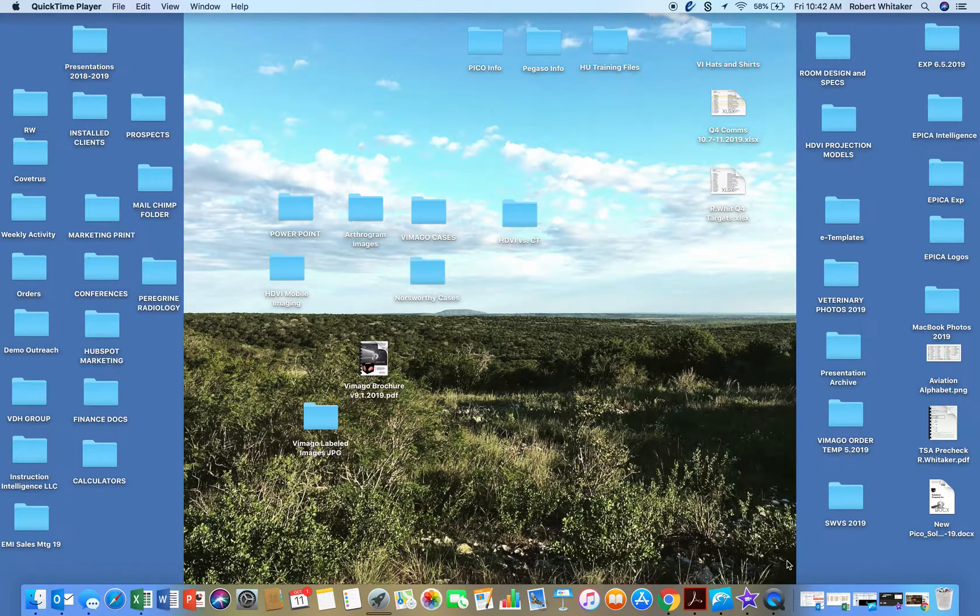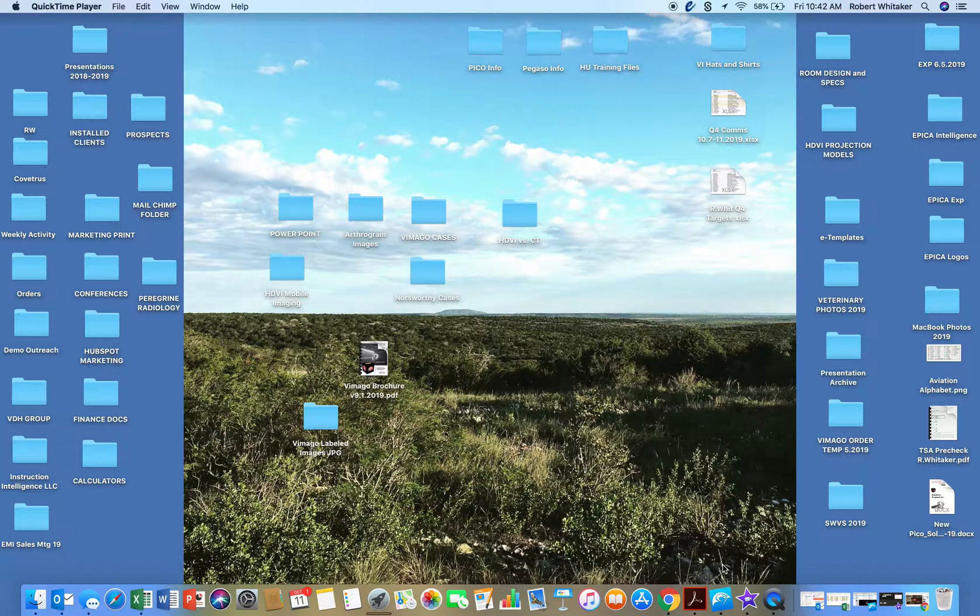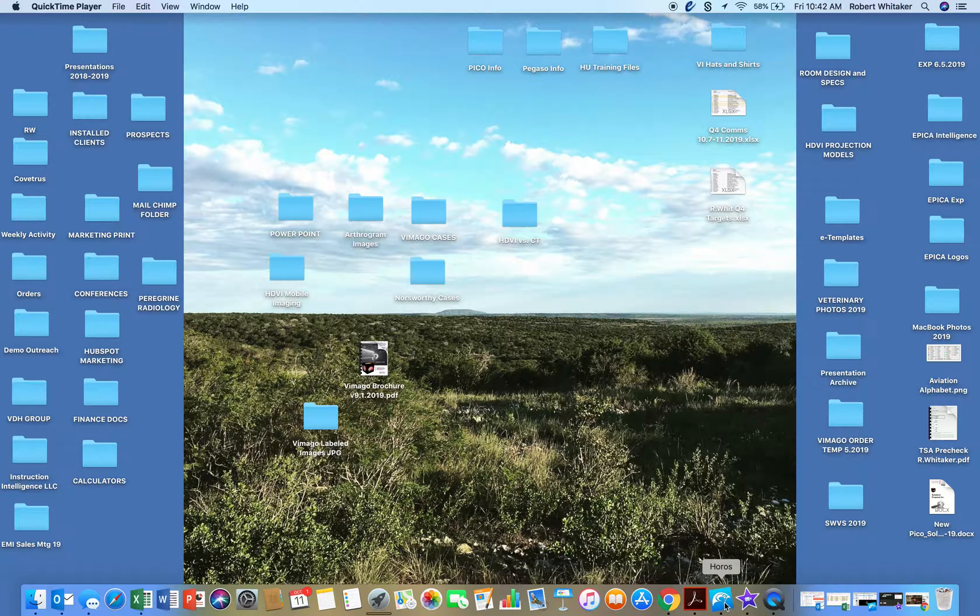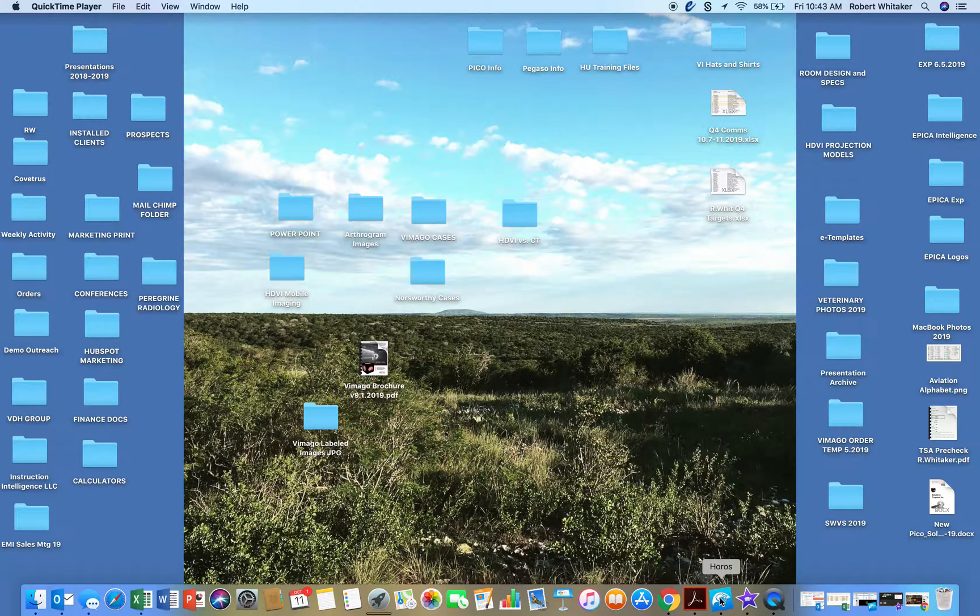Gabriel, I'm going to show you how to do dentals on Horos. So my Horos, this is what the app looks like. It's a blue icon down here at the bottom of my screen.